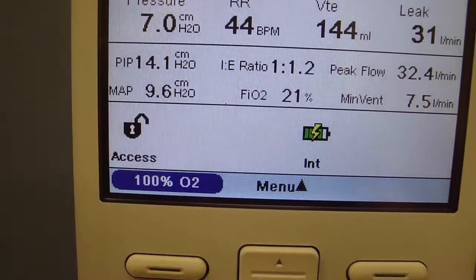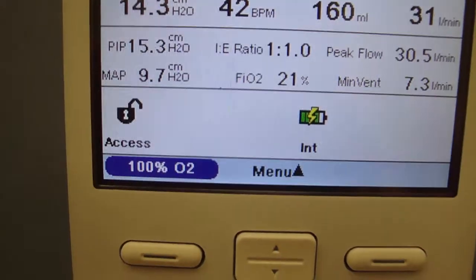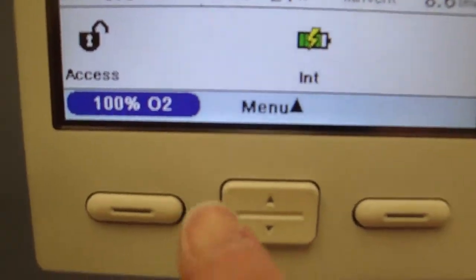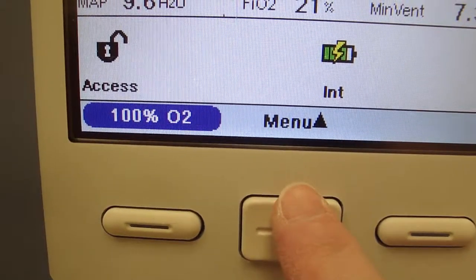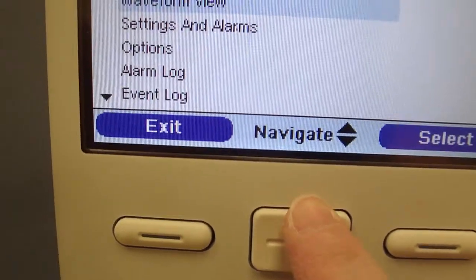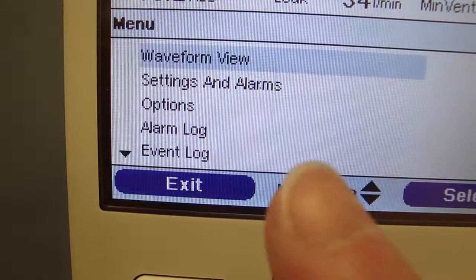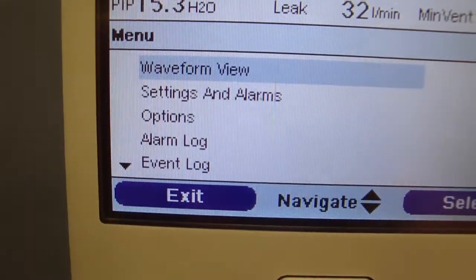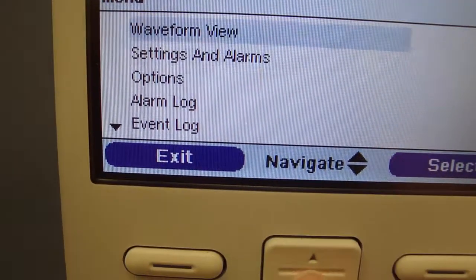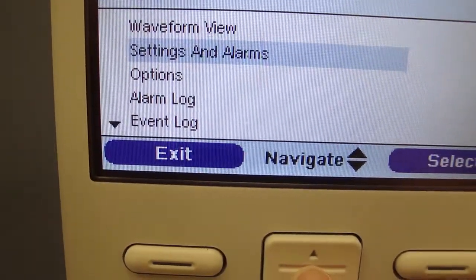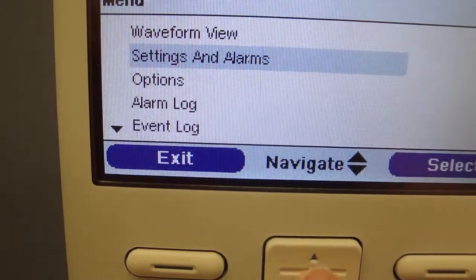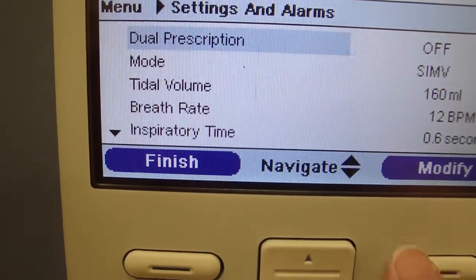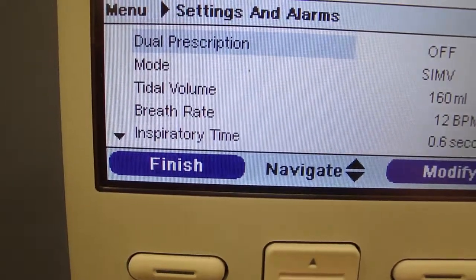If you'd like to check your ventilator settings to make sure that they match your orders, you can come down to Menu, Up Arrow, and then we're going to look for Settings and Alarms. Use the switch and toggle down to Settings and Alarms, then Select, and now we can scroll through.